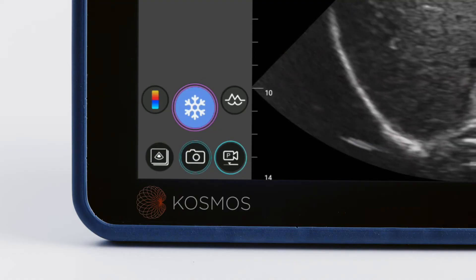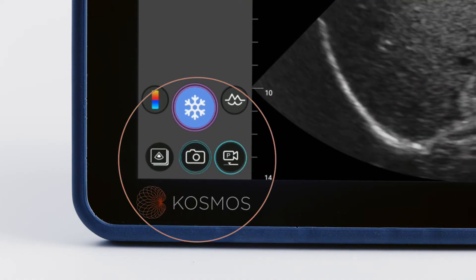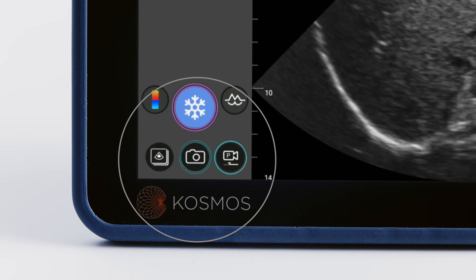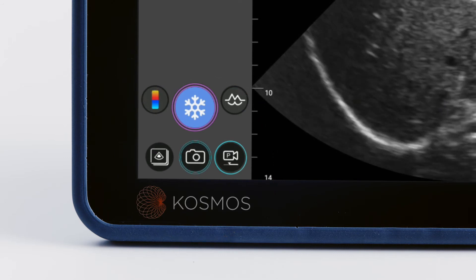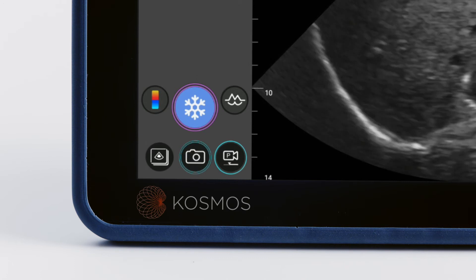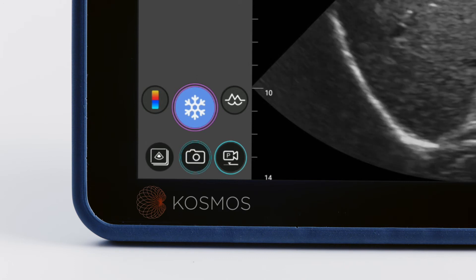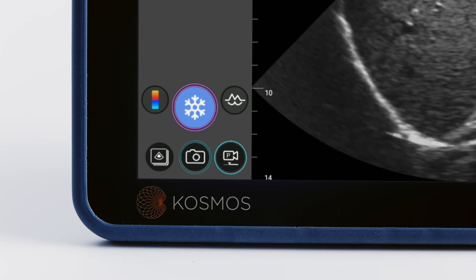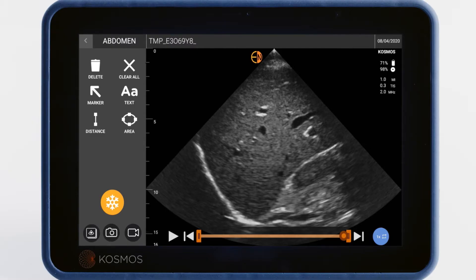At the very bottom of the menu, there are three icons. The first will take you to review saved images. The camera icon captures still images and the video recorder captures videos. The blue snowflake button is the freeze button, which opens another menu for image editing and annotation, which we'll review in video 8.